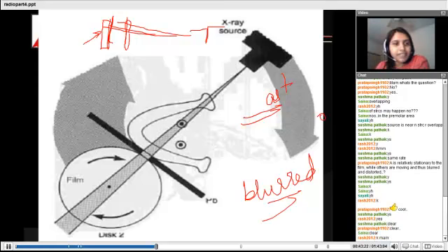Okay, Rashmi, fine. Now look at this particular point. Here the problem was that we focused our center of rotation with respect to this particular arc. Our mandible is not a round thing. If it was a round thing with one center of rotation, we could arrange the movement of the X-ray so that this particular object was always in focus and this particular object would pass in speed.